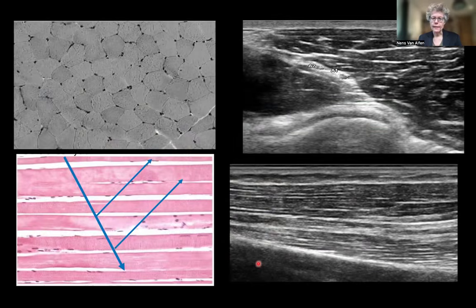And if you translate that a little bit further, you're looking in a transverse direction, you see muscle fibers, and longitudinally, you would see the ultrastructure. It sort of translates to the gross anatomy right here. So transverse, you have a beautiful anatomic feature. You see the starry night. You see underlying bone and cartilage layers right there. Longitudinally, you get this beautiful image of muscle pennation angles and fiber direction, which makes it a little easier to assess, for example, muscle tear.